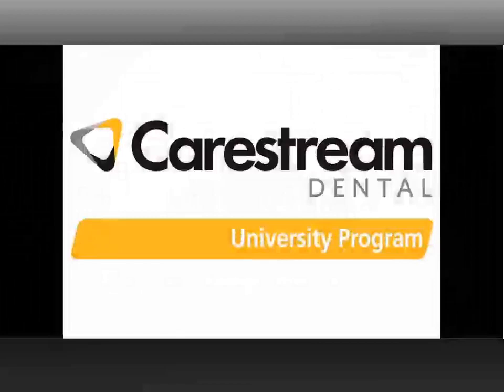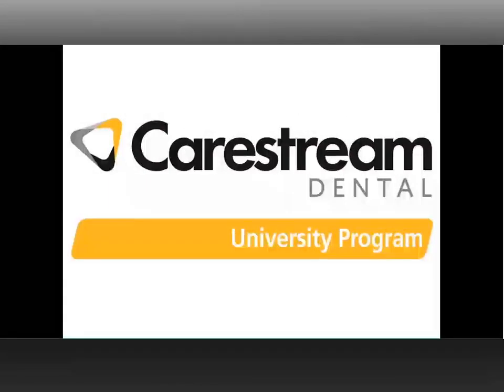Dr. Katal, before you begin, I'd like to introduce you. Dr. Shalise Katal is an oral and maxillofacial radiologist. He trained at the University of Missouri, Kansas City, and is a clinical assistant professor at the New York University's College of Dentistry, where he operates all advanced imaging services. Dr. Katal is currently the Director, 3D Imaging for Carestream Dental. Dr. Katal, welcome, and thank you for taking the time to join me to do this review.